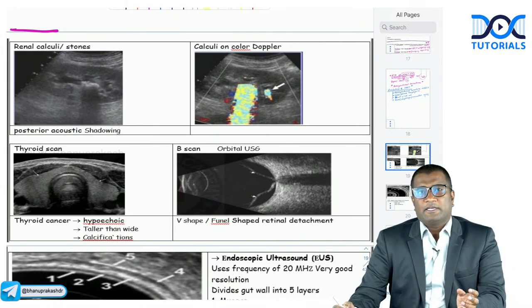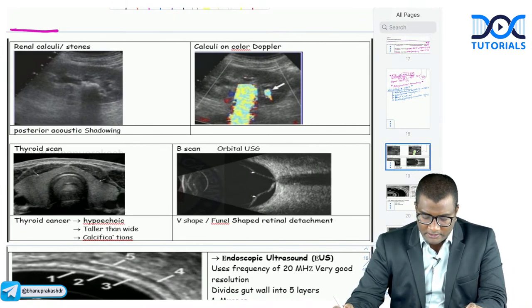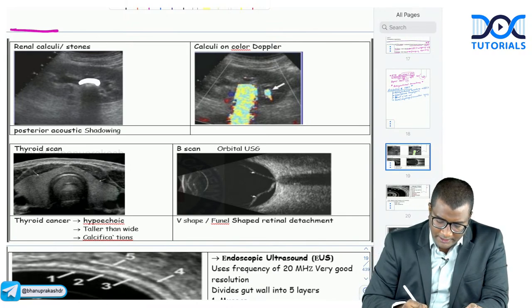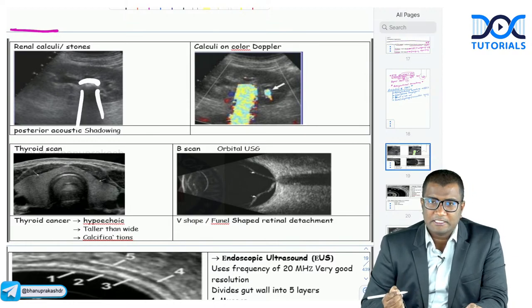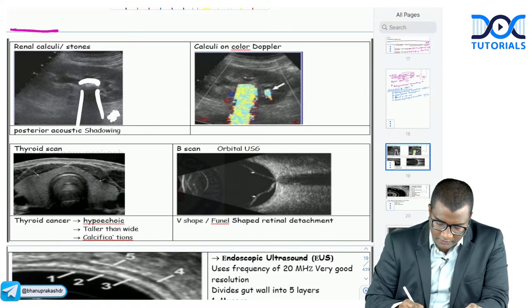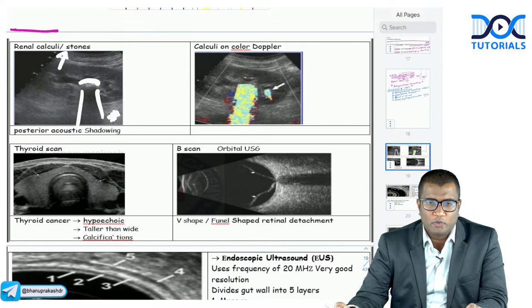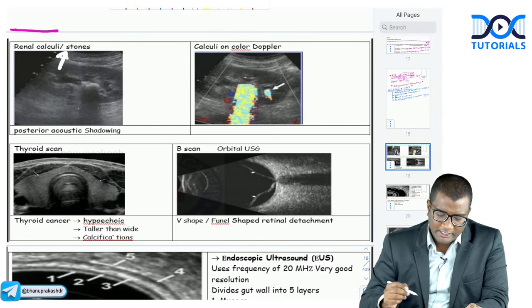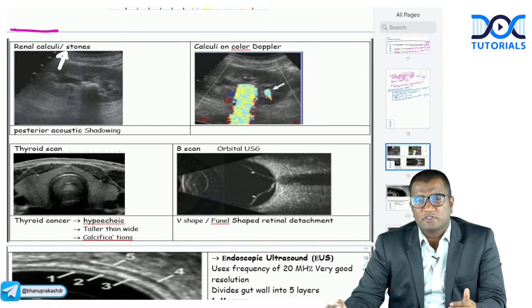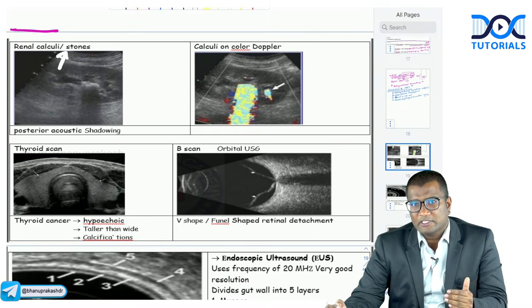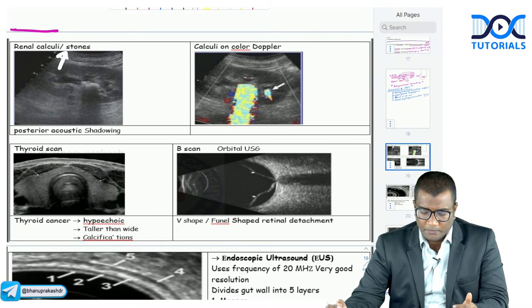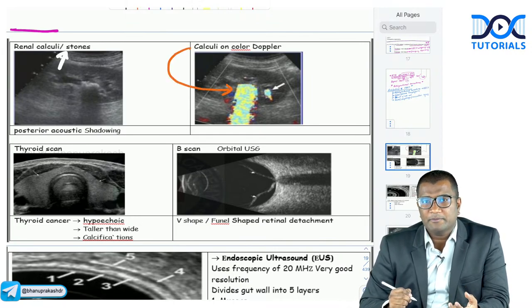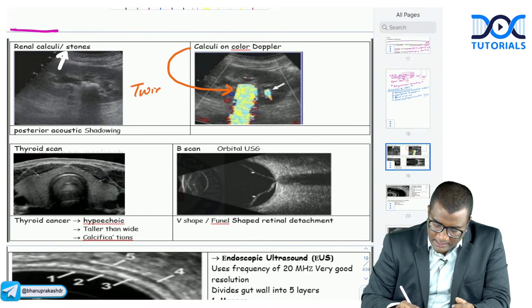Looking at important ultrasound images: a hyperechoic area with posterior acoustic shadowing is a calculus or stone — shadow for stone (S for S). On color Doppler, calculi show intermixing of colors called twinkling artifact. This image shows a kidney with a calculus and posterior acoustic shadowing. Pressing the color Doppler button shows the twinkling artifact — which occurs with renal calculi.